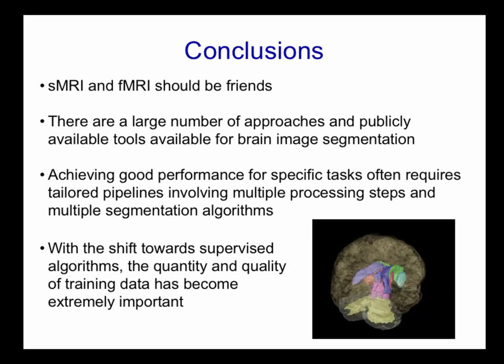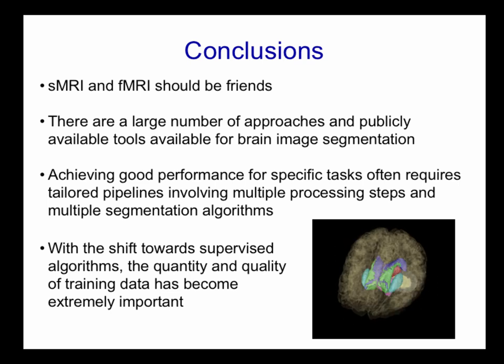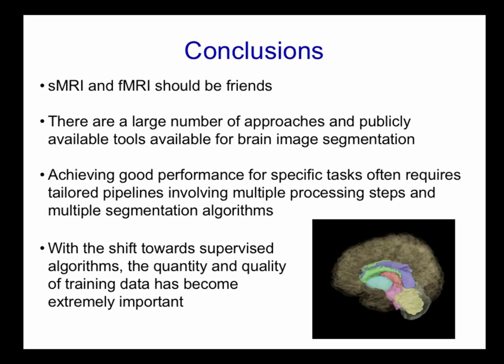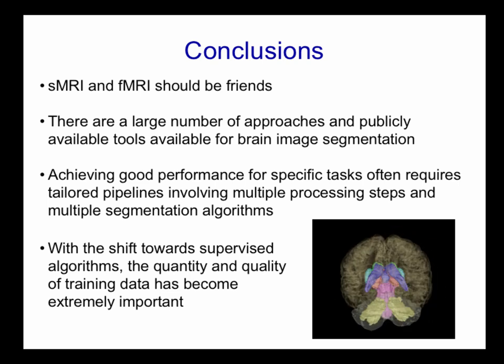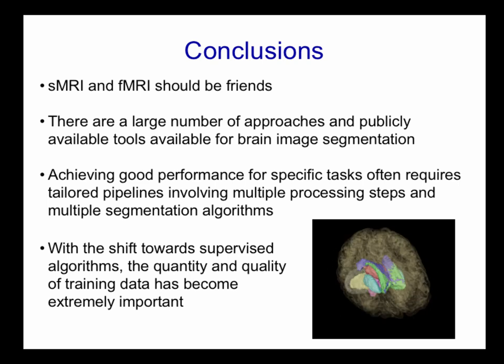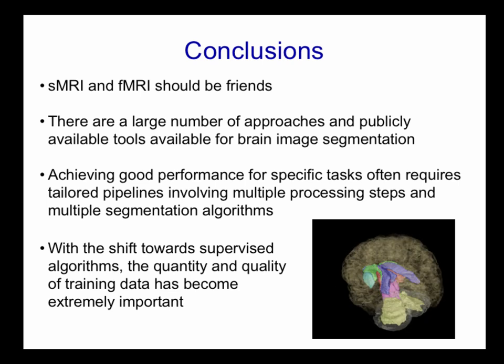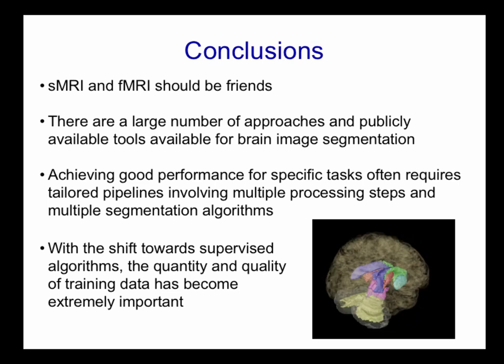Yes, there are a number of tools that deal with inhomogeneities and subcortical segmentations. FreeSurfer is not that bad, but there are probably more sophisticated ones out there. If you want to go state of the art, I would say some of these deep learning tools that I mentioned, I have some references to DeepMedic and one called DeepNat.